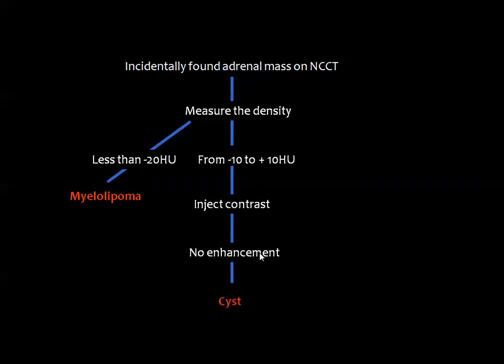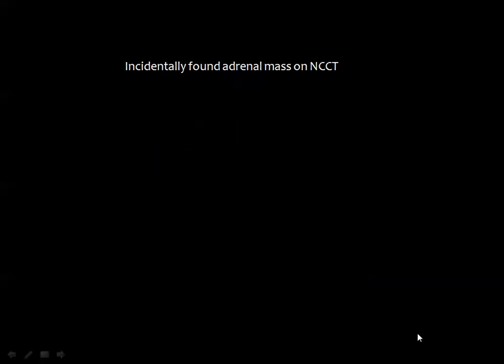If there is no enhancement, then you are dealing with a cyst in the suprarenal gland. But if there is enhancement, and not only enhancement but washout of more than 60% of enhancement in the delayed 10-minute scan, then you consider lipid-rich adenoma.